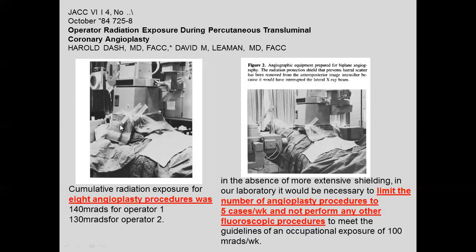But look at their radiation protection. They taped lead to the X-ray machine. And the lateral plane had none. And there's no undercouch lead that I can see, no above shield, so we've gotten better. That's it.